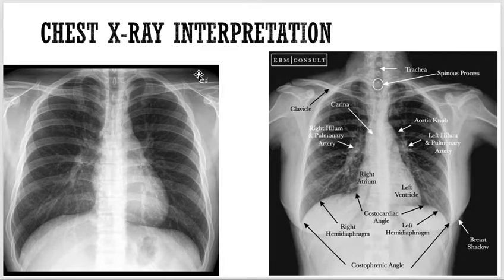You will mostly find the name of the patient, the age of the patient, the date of birth of the patient, the date taken, and the film number as well, like in the real world. When you are in the hospitals, always check the name of the patient, the age, the date of birth, the X-ray date, and all those things.